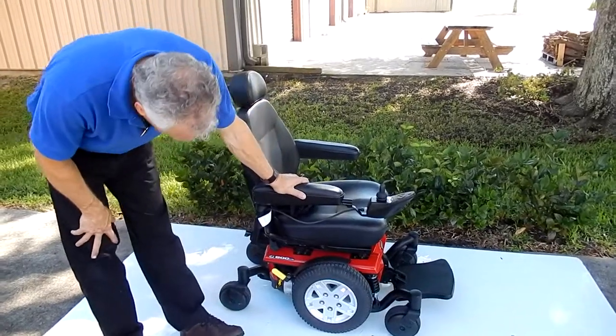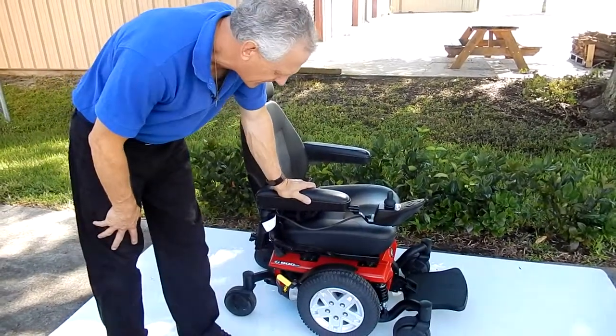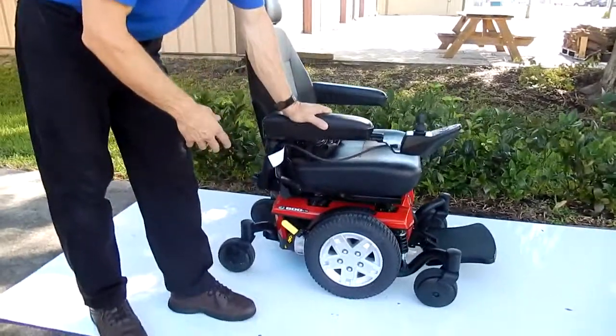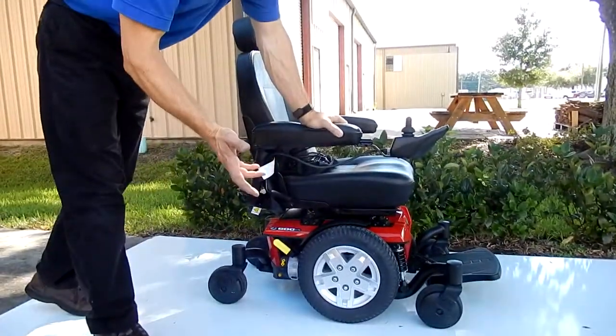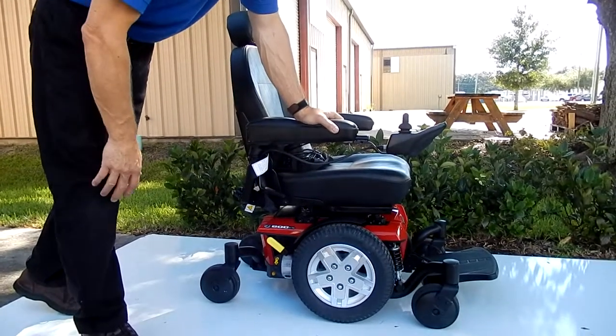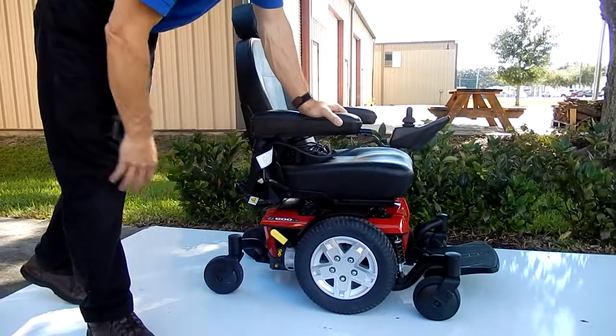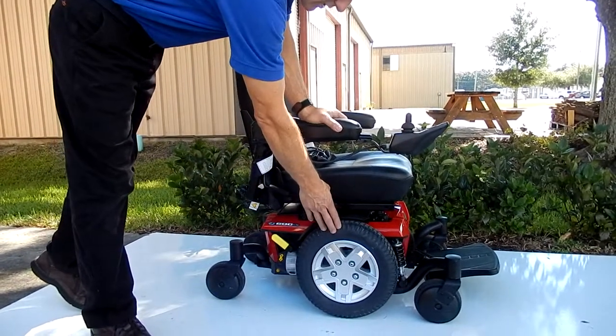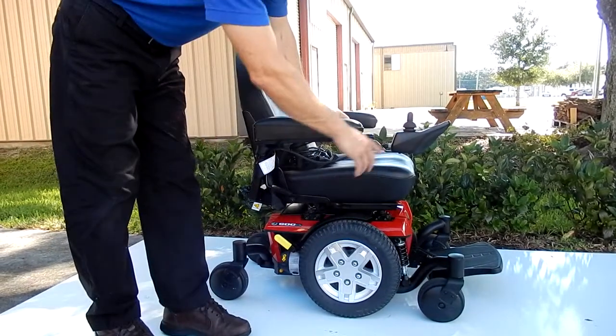This is a Jazzy 600 ES — six wheels on the ground. This chair is practically new, as you can see. I don't think it has more than a month or a week or two of usage. It's kind of hard to tell. The tires are brand new all the way around. It's got the newer dark gray tires on it, and they're solid all the way around.